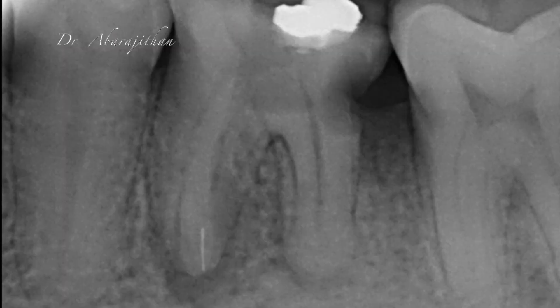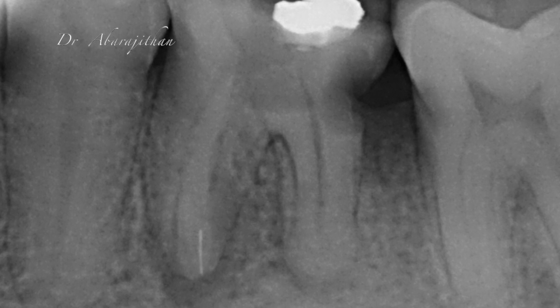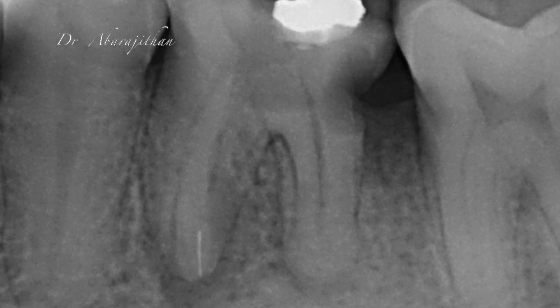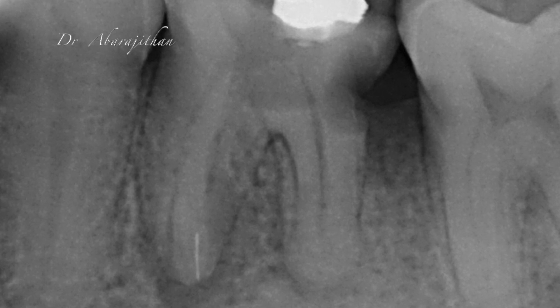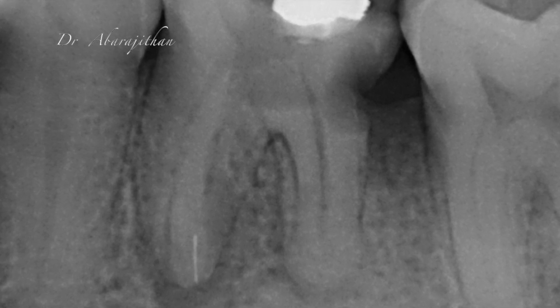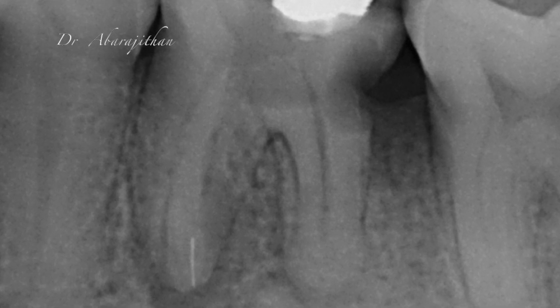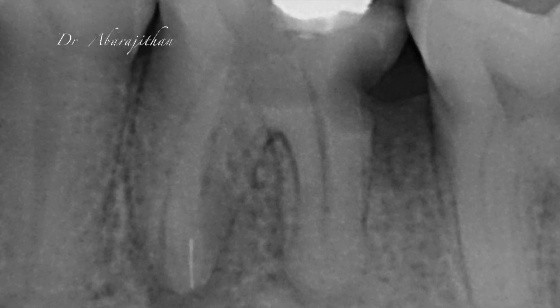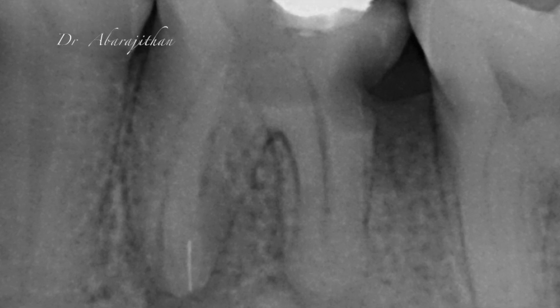At the end of the day, what I want you to take home is that instrument retrieval is a very serious business and it's not easy without magnification. The aim of this video is to show the mechanism and indication of these micro-loop methods and what a general practitioner can do when an instrument fractures in the coronal third — when you can visualize it, when you can see it's moving, but you cannot pull it out. These systems can be useful.